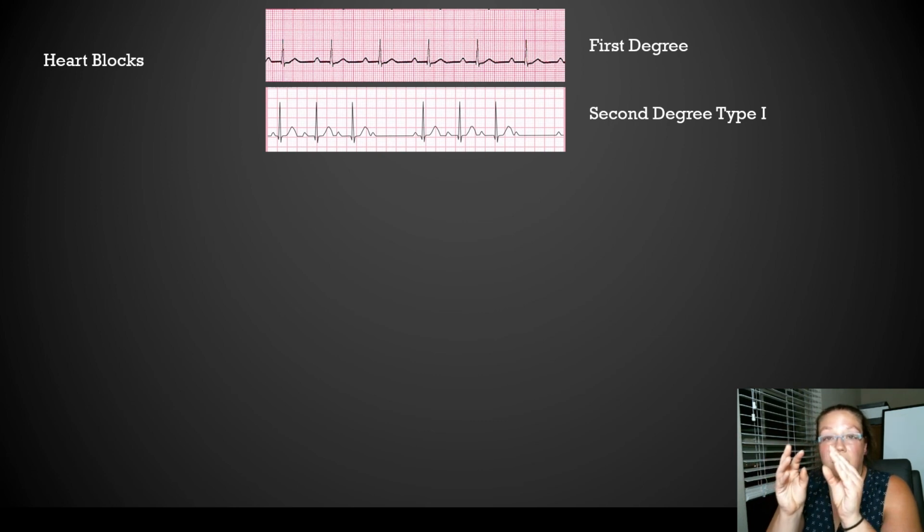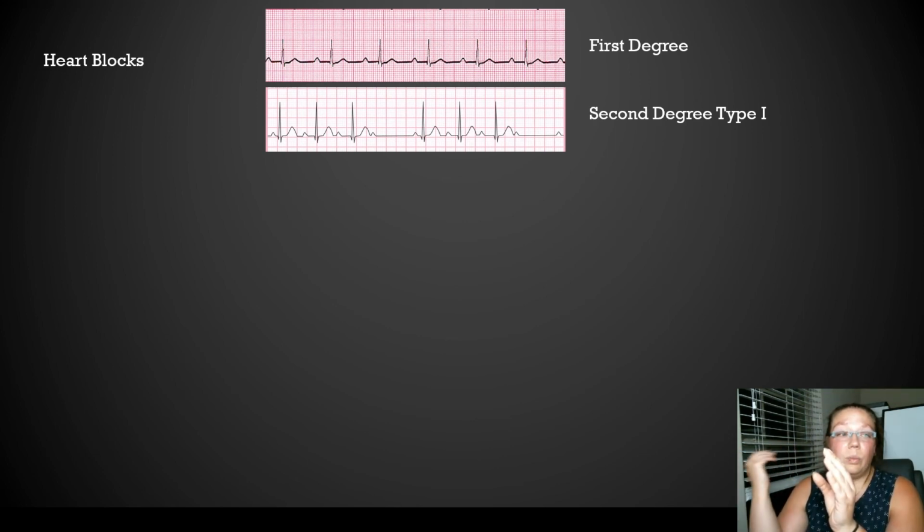So they're close together, right? Start over. After that spat, QRS comes home on time. Boom. But then the next night, QRS comes home a little bit later. And then the next night, he comes home even later. Until one night, he just doesn't come home. Again, P and QRS are short. There's a short PR interval. The next time you see it, it's a little bit longer. The next time, it's a little bit longer than the second one. And then all of a sudden, P is by itself. Wenckebach. PR, long, longer, drop.